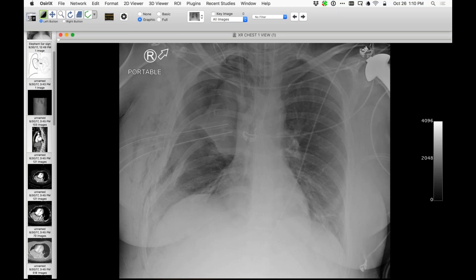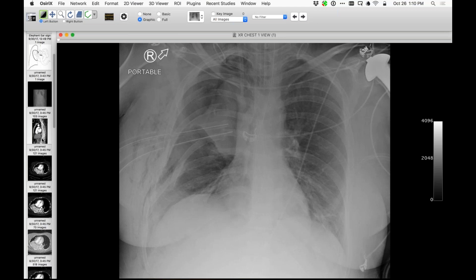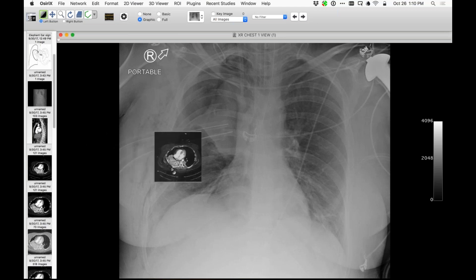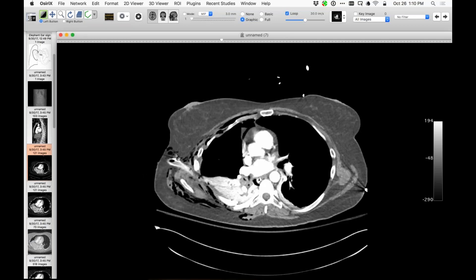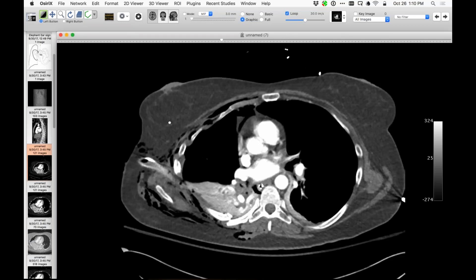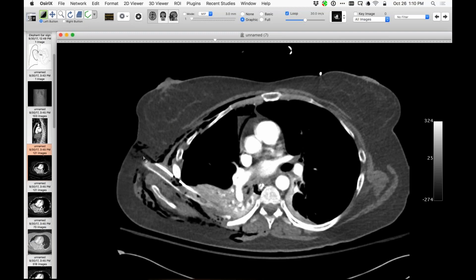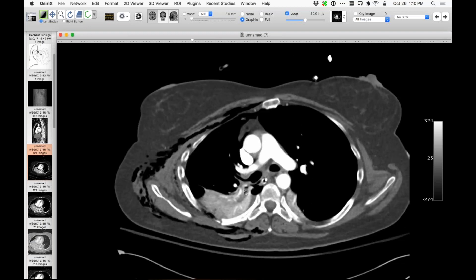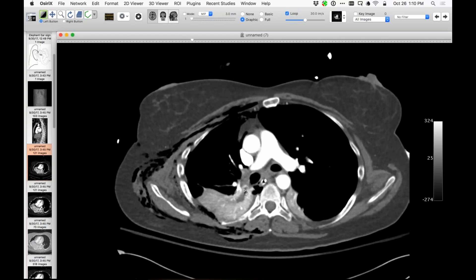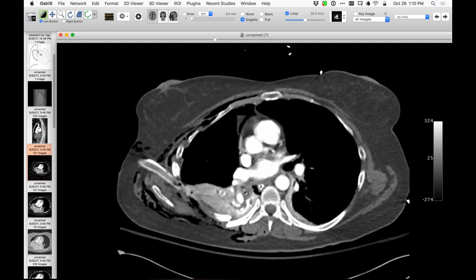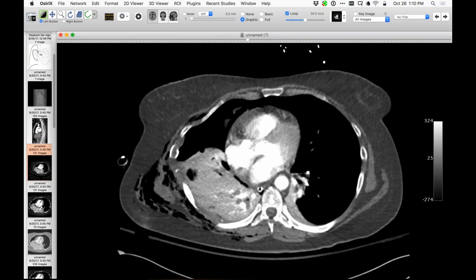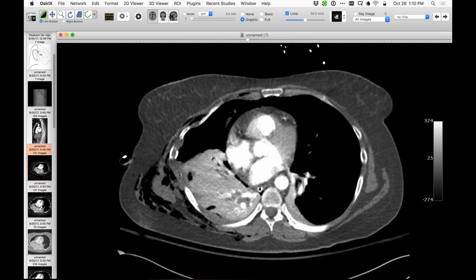Let me go and show you a CT that was done not too long after admission. Take a look at the extent of atelectasis. Here, for example, we have quite a bit of secretions or aspirated material in the posterior segment of the right upper lobe. When we go down, we see substantial atelectasis involving the right lower and middle lobes, the middle lobe being down here at that time. So a lot of atelectasis is present on the 30th.